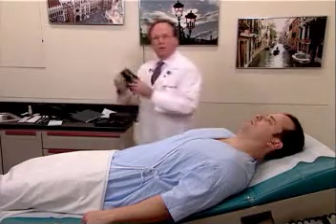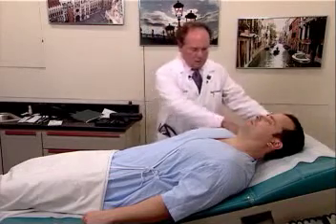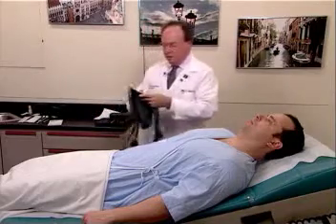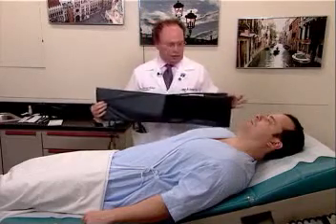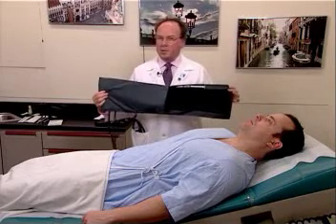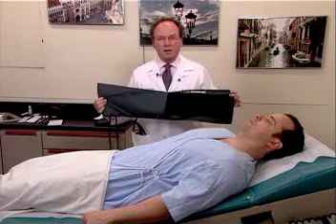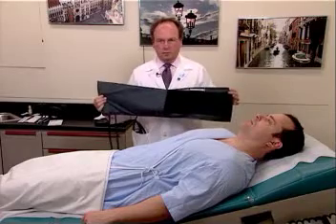This is the pediatric cuff, which is obviously used for children. And the fourth cuff is the thigh cuff, which is used for blood pressure determination in the lower extremity. Remember that blood pressure in the lower extremity is always higher by about 15 to 20 millimeters than in the upper extremities. This is applied to the thigh, and the stethoscope is placed in the popliteal fossa for evaluation.